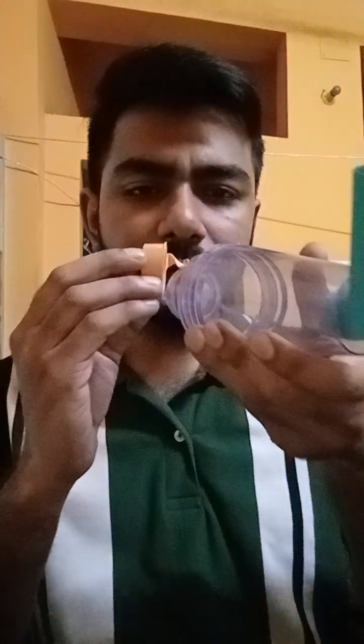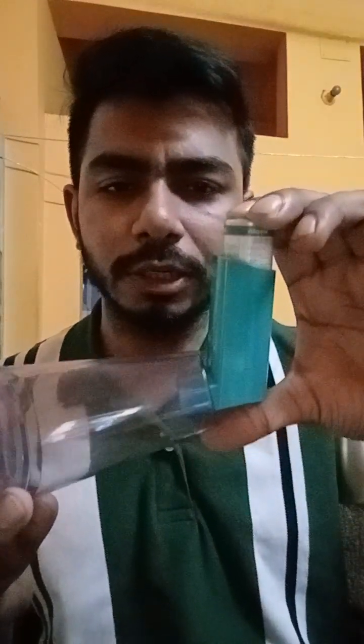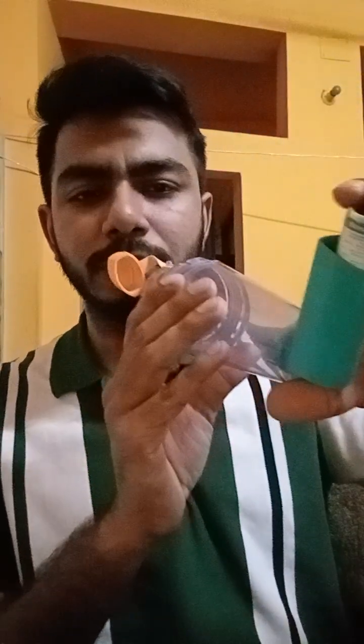and then exhale it out. After exhaling fully, you will put this mouthpiece into your mouth and seal the lips around this mouthpiece, like this, right? And then you will deliver a dose like this, and you will hear a clicking sound like that. I hope you heard it in the video, right? Once you have done that, with the lips sealed around the mouthpiece, you will take a deep breath.